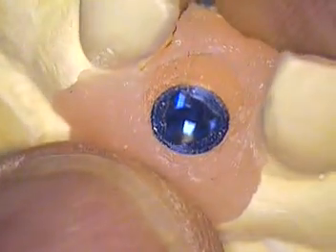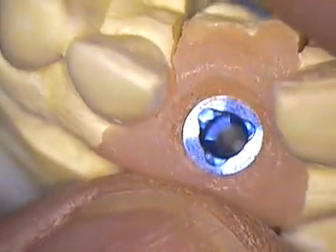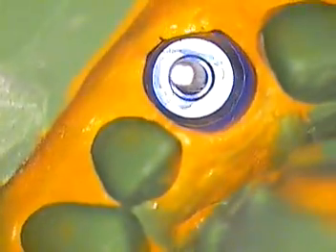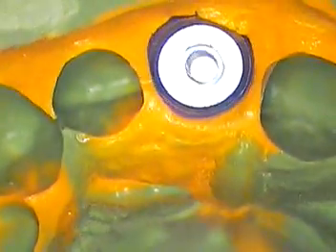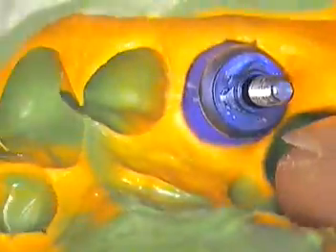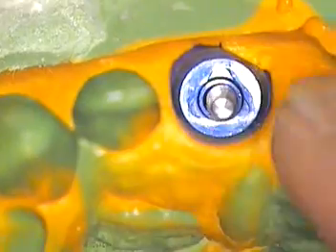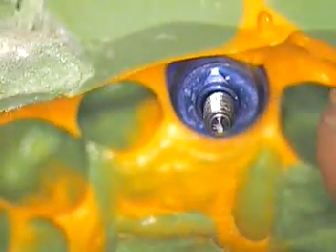But how did we do that? If you look at the impression, you're going to find that this particular model has the flare to it and around the tissue, because we designed that inside of the impression coping. So this is the impression coping, modified before the patient came into the chair and sat down. And if you notice there's a blue silicone block-out material that we used in other cases.